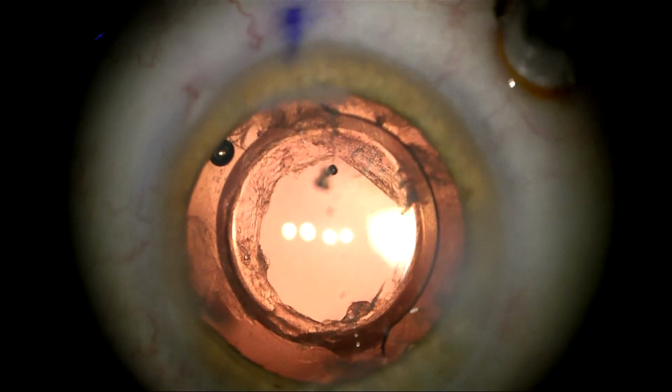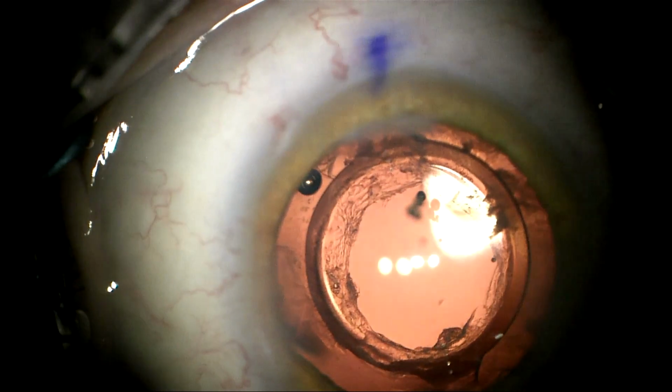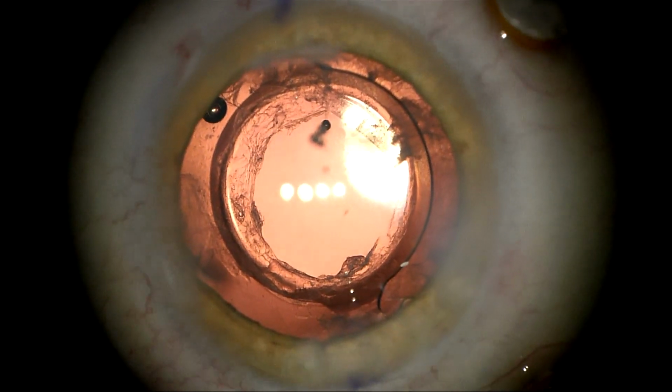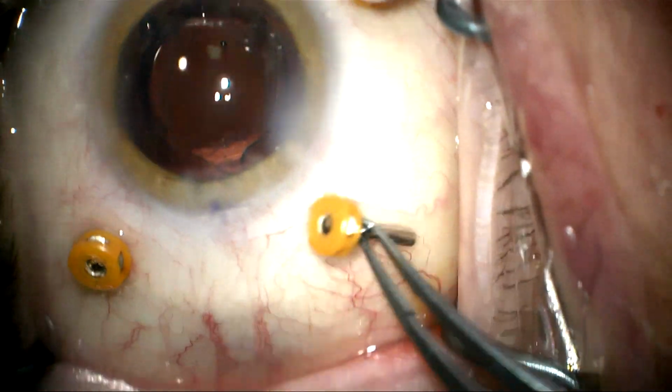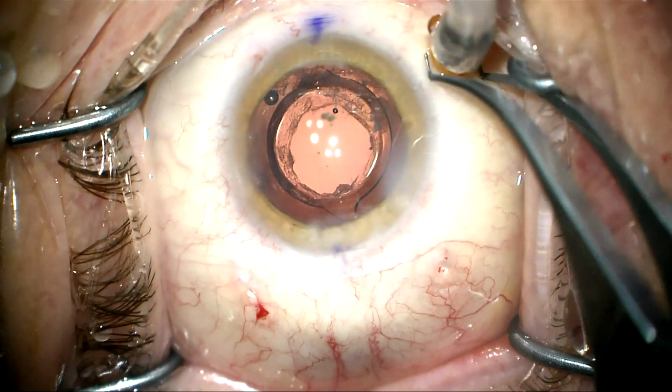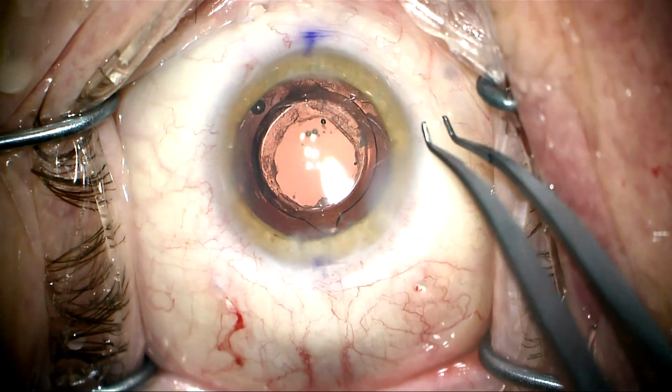Now looking with the red reflex view, you can see the anterior capsule rim at 6 o'clock, and this demonstrates that the lens is indeed on the proper axis and in the capsular bag equator. The trocars are removed and the case is completed.